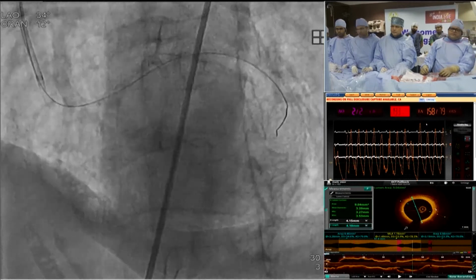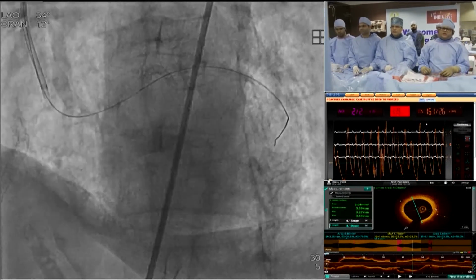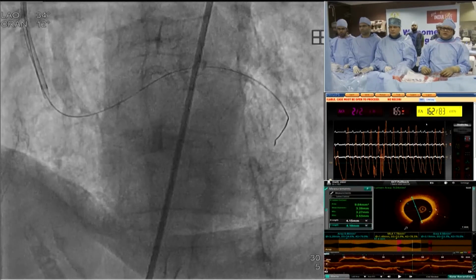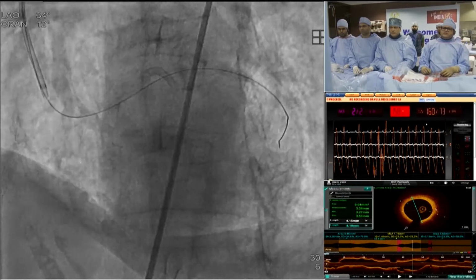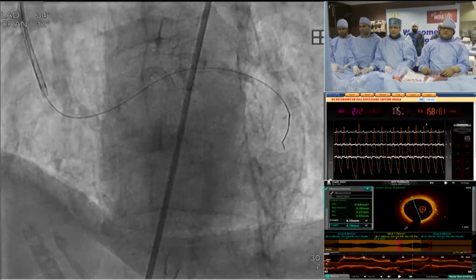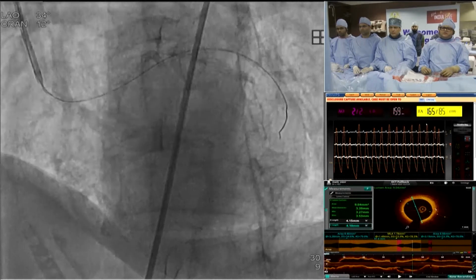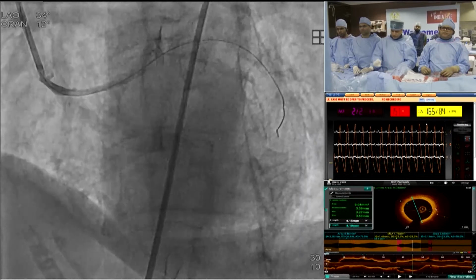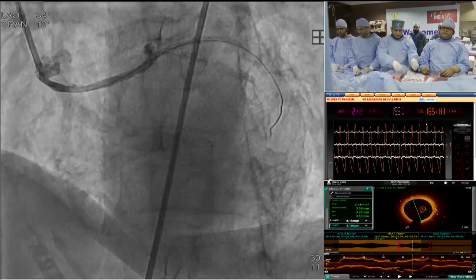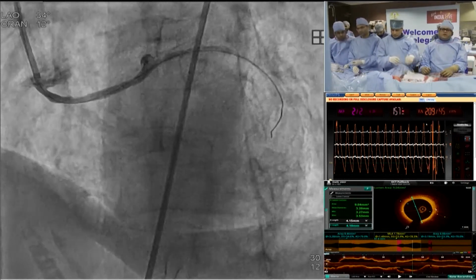So I'm going ahead with one stent in the circ and one in the left main, a 4 by 23 Giants. It's too long, so I have treated with just the one stent in any case, sir. And there's a difference in sizes. Exactly. There's a disparity in the diameters. The circ has a very nice proximal landing zone before the bifurcation. I'd put one stent in the circ. Absolutely. You don't have to compromise the LAD. Exactly. And then a bigger one more proximal in the left main. So we think you should fix the circumflex and left main separately.